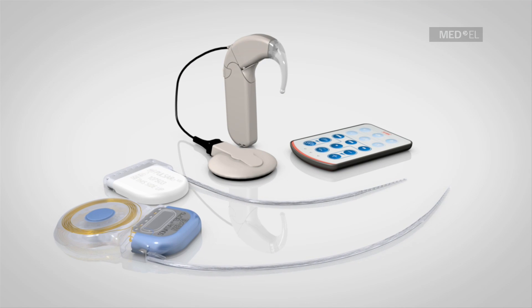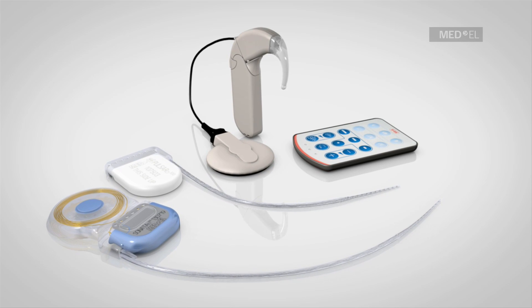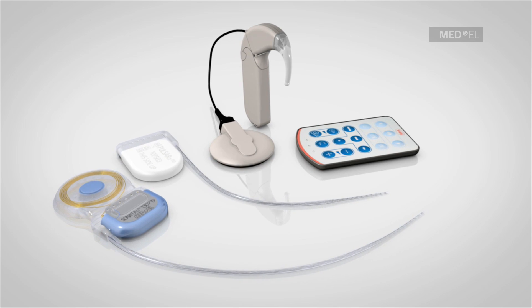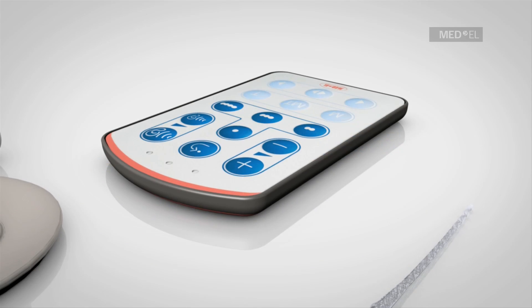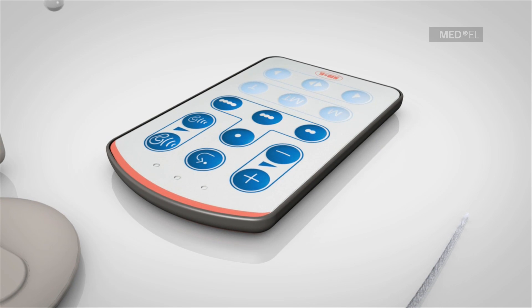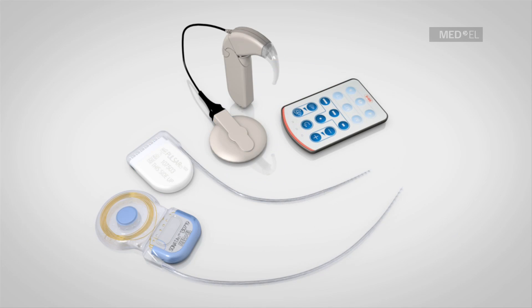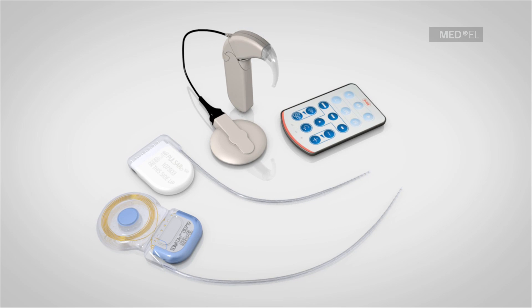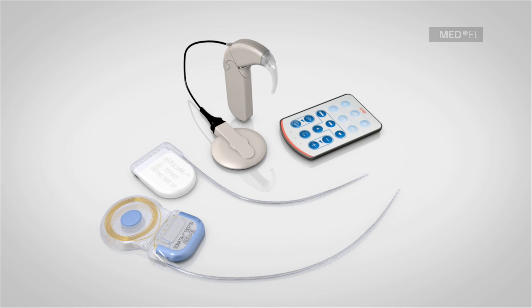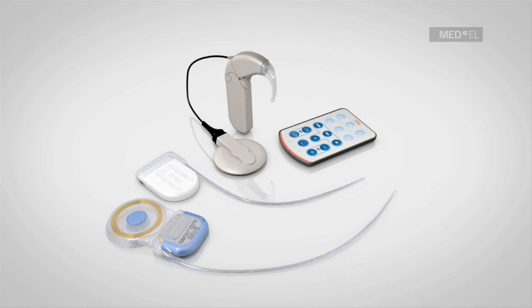The Maestro Cochlear Implant System takes advantage of the newest developments in both hardware and software technology and is designed to be easy to use for both children and adults. The fine-tuner remote control unit allows users to make setting or volume changes easily and comfortably without the need to remove the processor from the ear. Whether in a noisy restaurant or a quiet park, Maestro's automatic sound management technology adapts to changing listening situations for an optimal hearing experience in every listening environment automatically.